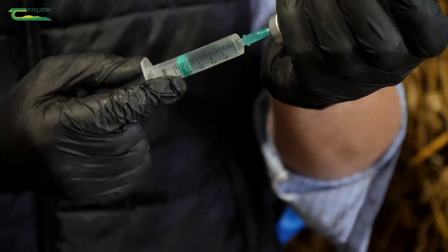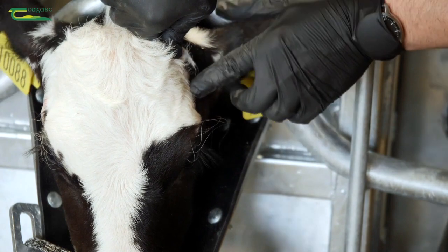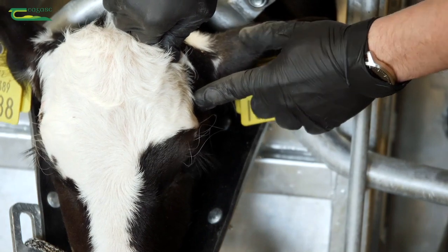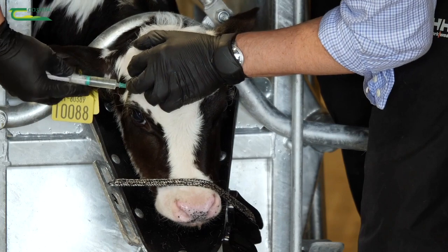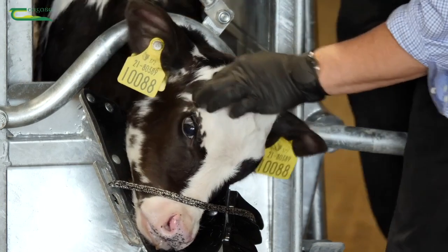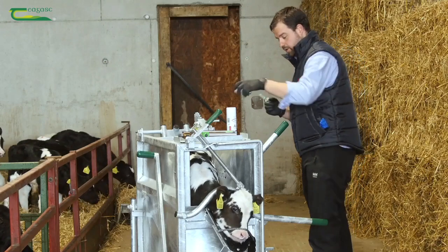For injecting the local anesthetic, we take the horn bud, which is right here, and we take the corner of the eye, and we draw a line between the two. Along that line, midway, you'll find there is a bony ridge, and just below it is a little divot, and it's in that divot that you have to inject your local anesthetic. Gently inject that. Now draw back on the plunger to make sure that there's no blood, and then you can gently inject the calf four to five mls. Now obviously that's only one side done, so you want to do the other side for disbudding both sides.